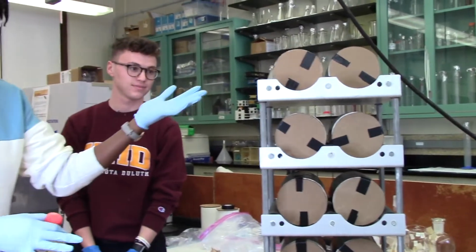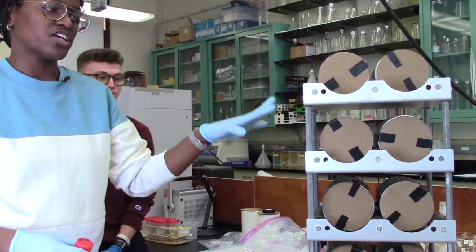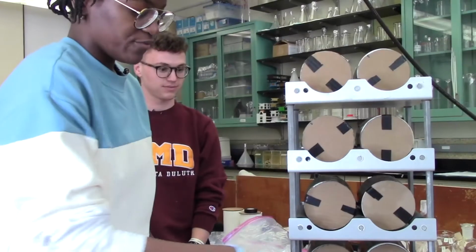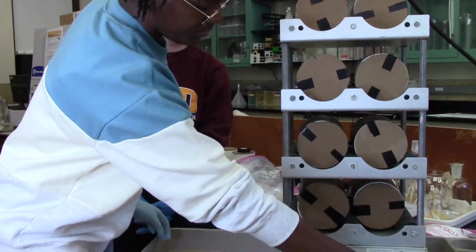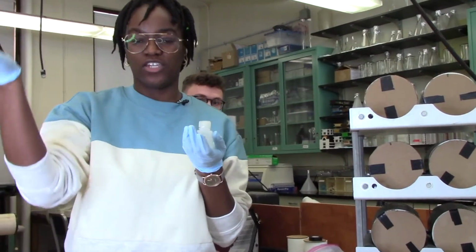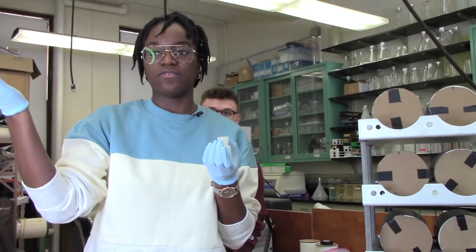This is very important because it's allowing the resin strips to come in full contact with the sediment that they've been placed in. So after the extraction process is done, we would take the resin strips out from the tubes and grab the solution, and then we'd use it on the AQ400 using the analyte phosphorus.